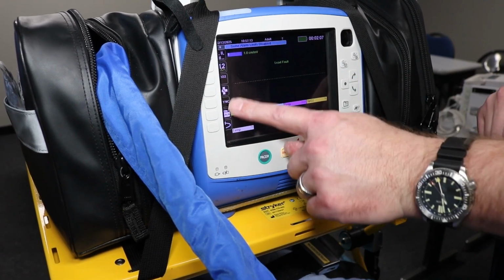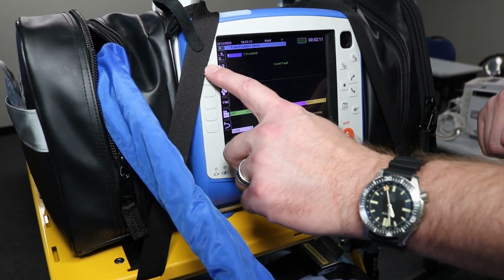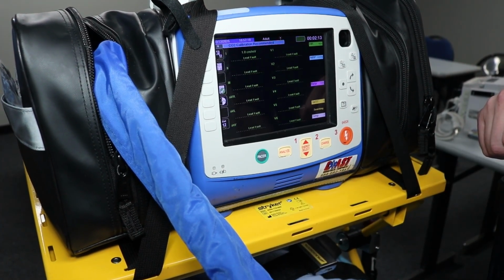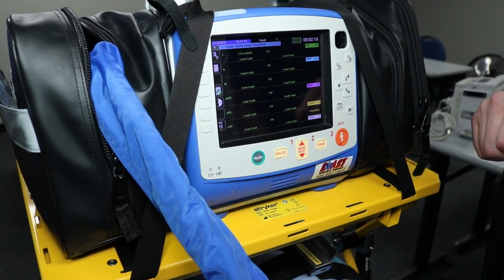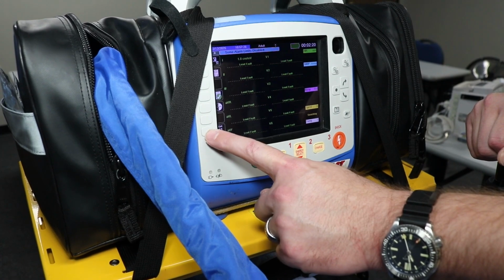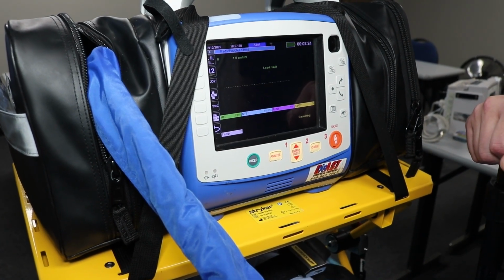You can see a set of quick access menu buttons here. If I wanted to utilize 12 lead, I would hit this guy. That would turn on my 12 lead, and I can take a snapshot by pressing that button again, or I can exit out by pressing the bottom button, and that will take me back to the home screen here.